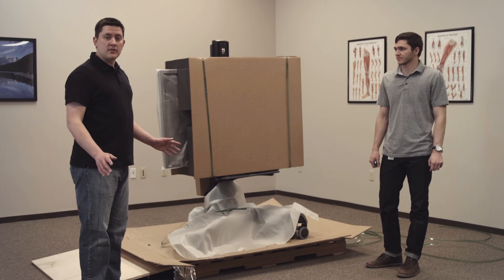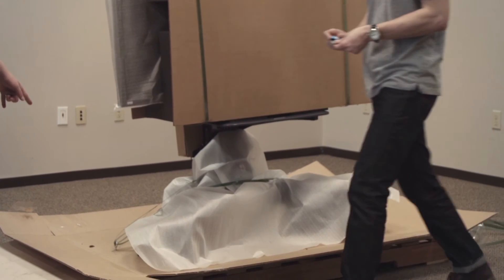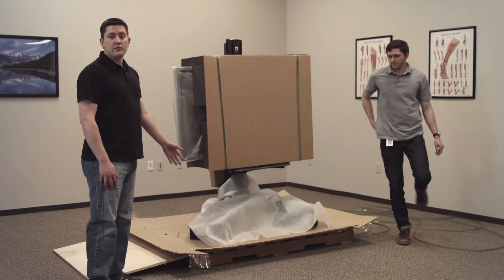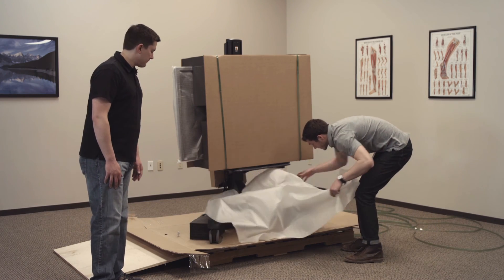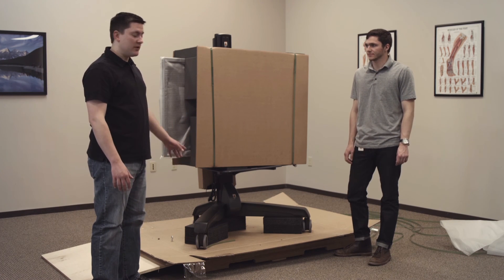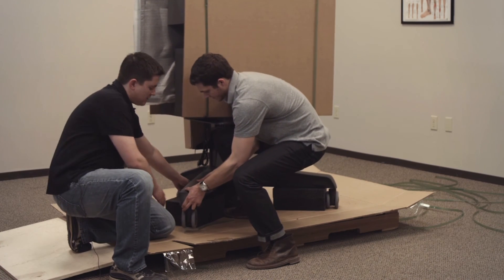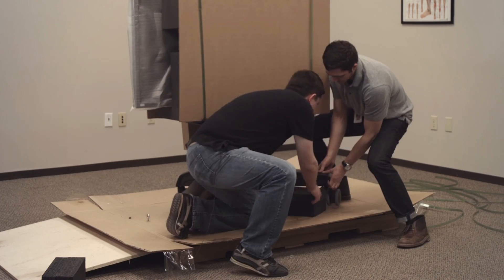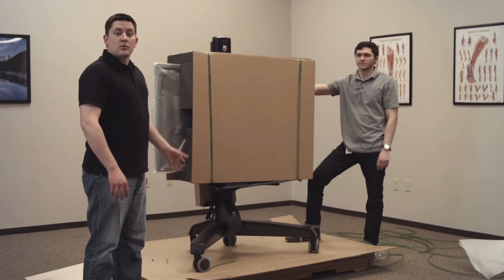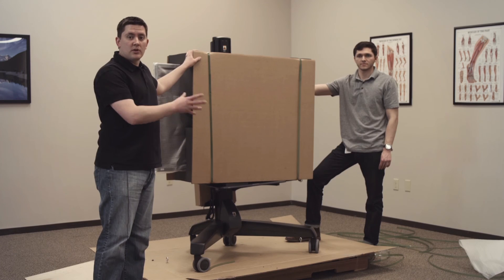Now we're ready to cut the straps that are holding the BITS system on the pallet — we're going to cut those at the anchors down at the bottom. We're going to remove the foam wrap that's covering the base. Before you roll BITS down off of the pallet, remove these foam blocks by putting a small amount of upward force on BITS and pulling them out. We're going to leave the foam and the cardboard strapped onto the monitor when we roll it down for safety reasons.